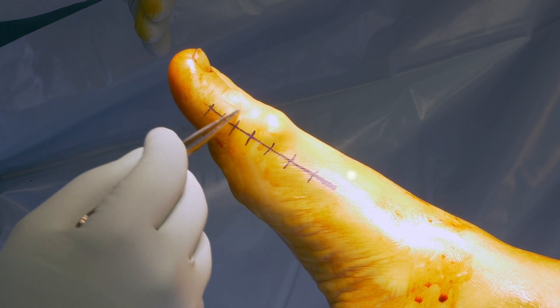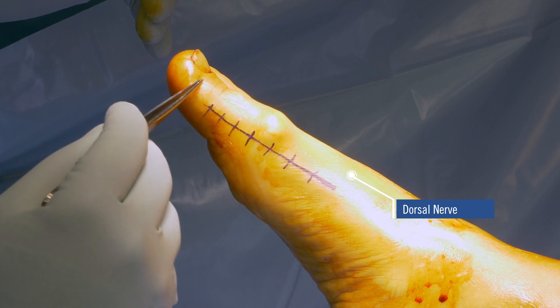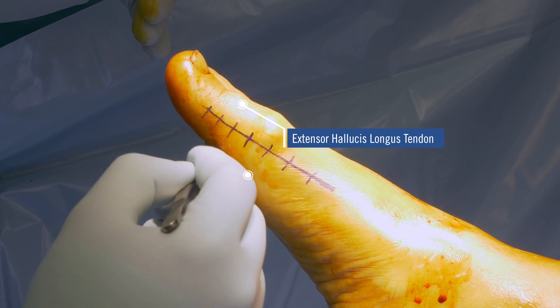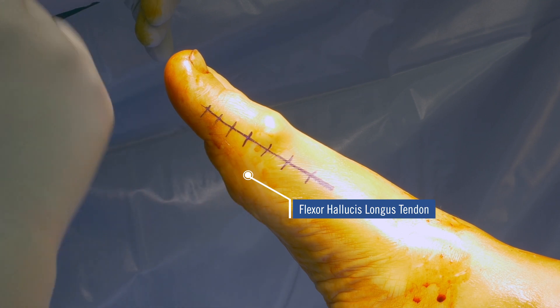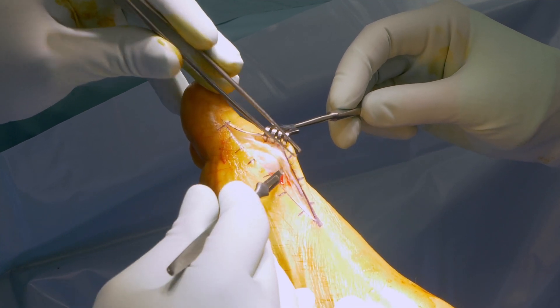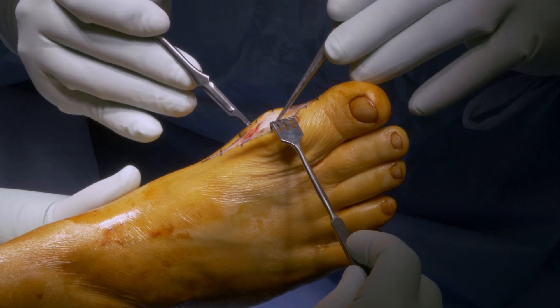Structures at risk are the dorsal nerve in extension of the saphenous nerve, then the extensor hallucis longus tendon, and below the capsule with the flexor hallucis longus tendon and the sesamoids. A medial incision of about 4–5 cm is performed. After exposure of the capsule, the dorsal nerve is visualized and prepared to the dorsal side.